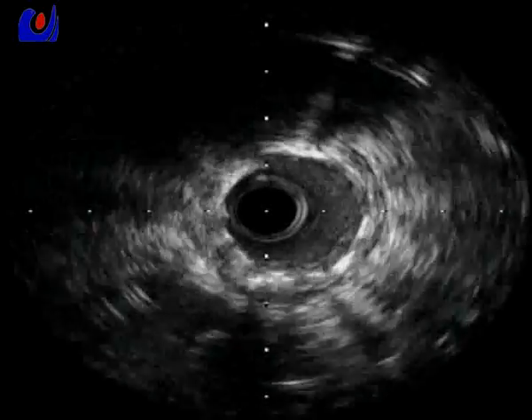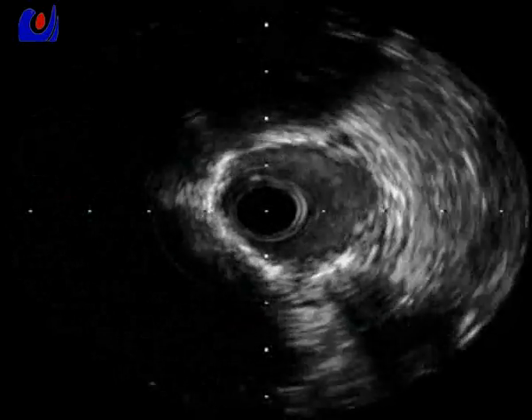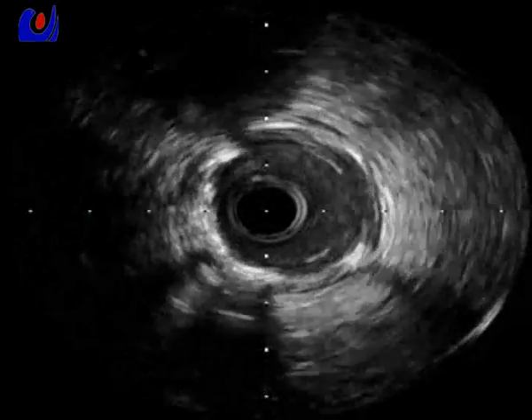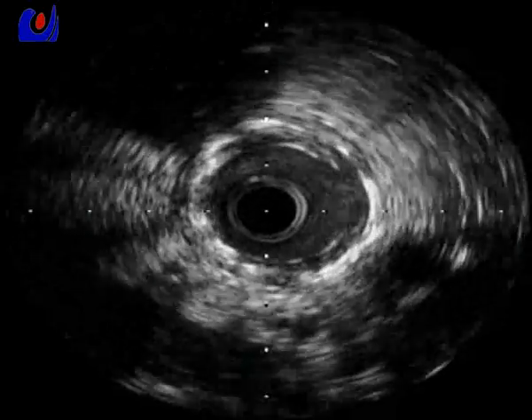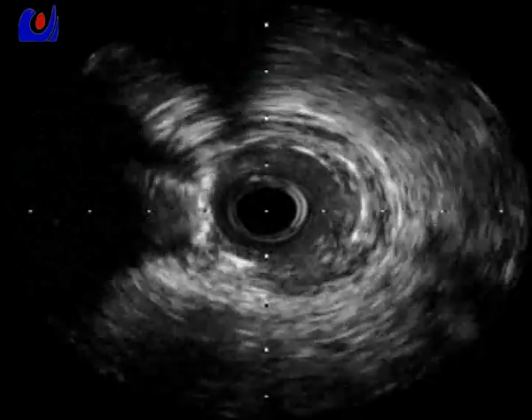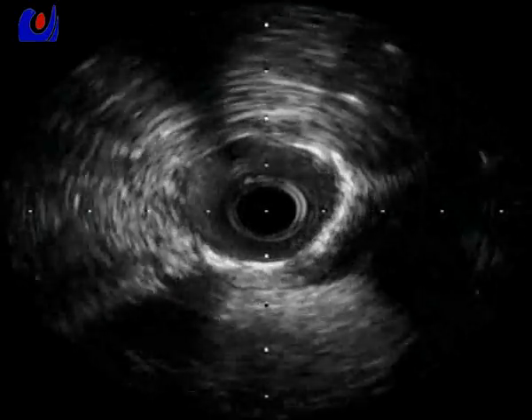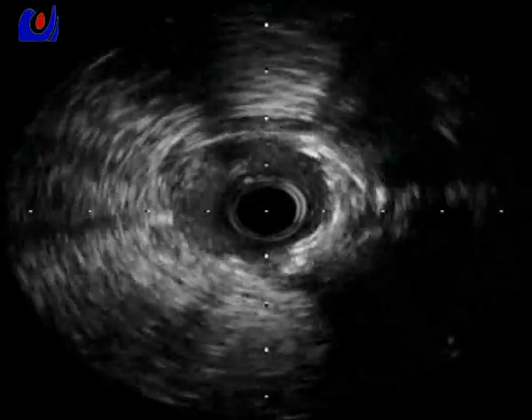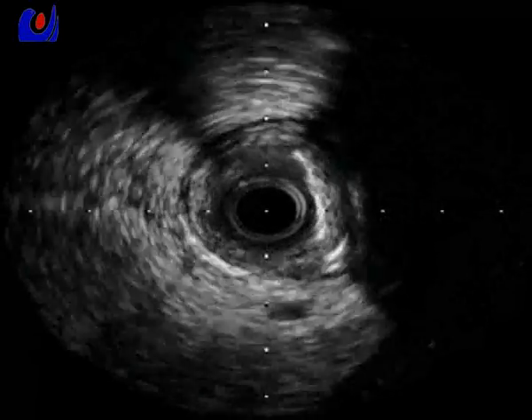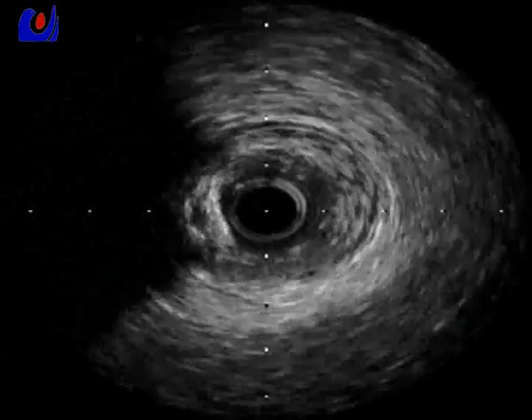Because now we can see some 90 degrees, but you can see that the calcium line is spread. 90 degrees of calcium is okay. But you can see that there is some disruption of the plaque, at 9 o'clock, here at 3 o'clock, and 8 o'clock. So it's a good thing because we can achieve this kind of popping. The stent expansion should be no problem.